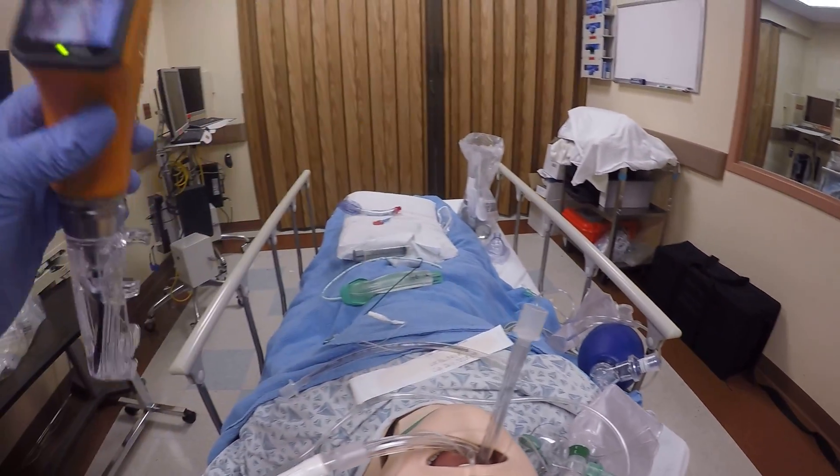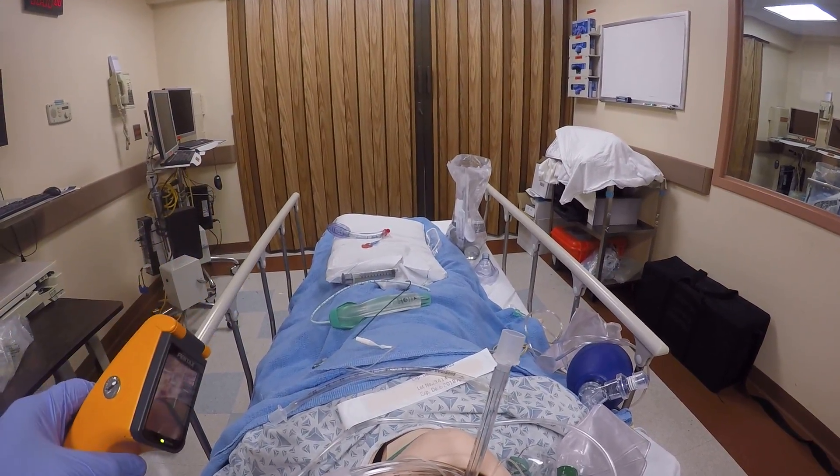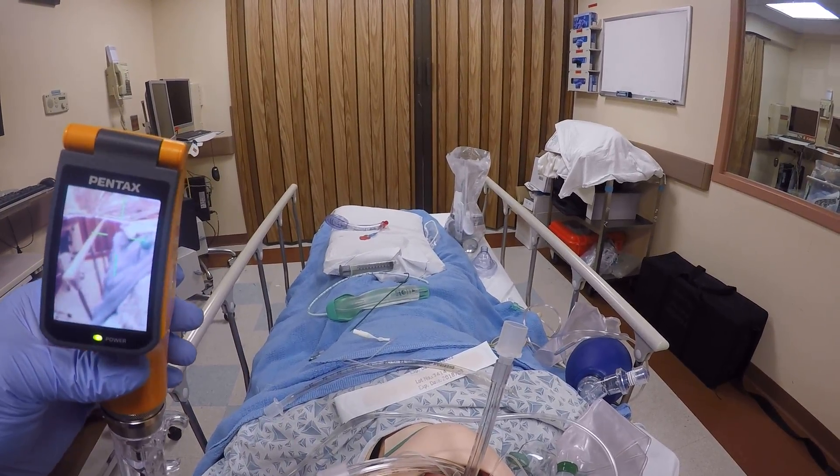At least in the sim lab, with the AWS 100 Pentax channel device, the gastric diversion works. Thank you.